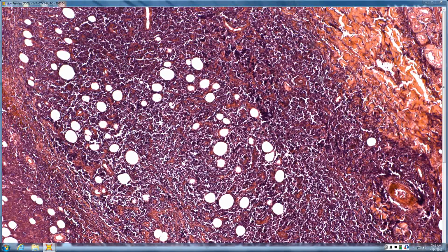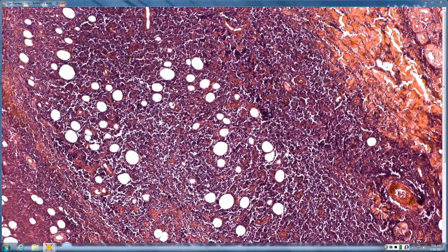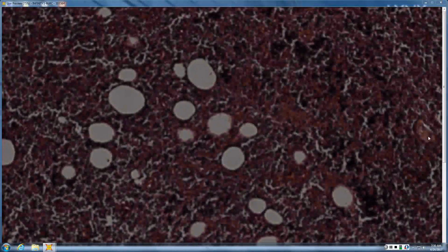In lymphoma, you have this infiltrate that, if anything, is bigger, and yet there's less reaction. It's like you want to shake the follicle and say, "Don't you see what's going on all around you?" In reactive, you get a little bit of inflammation and a lot of reaction of the follicle. In lymphoma, you've got disproportionate big infiltrate, and yet the blood vessels, the follicles, they're oblivious to all the squalor around them. So those are all clues at scan for lymphoma versus not lymphoma.